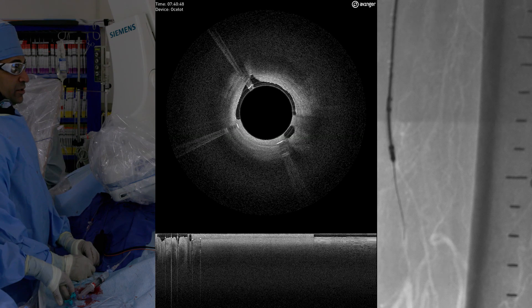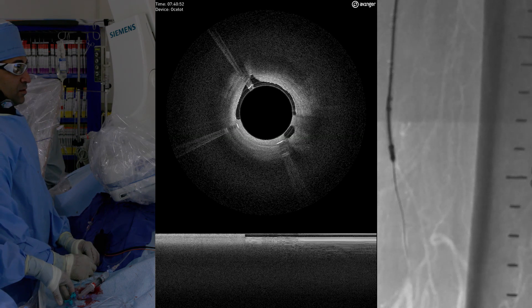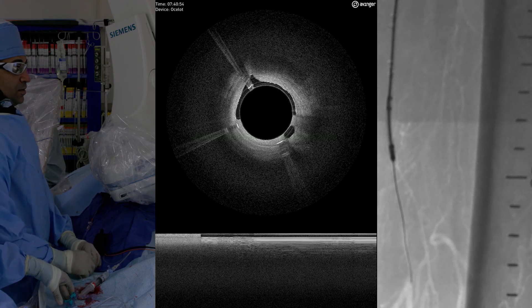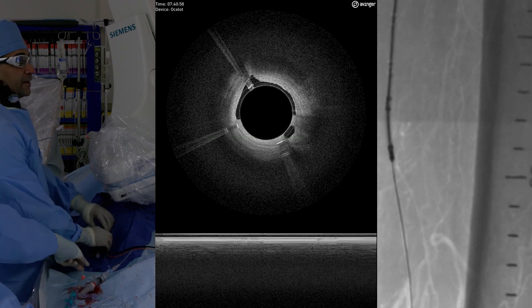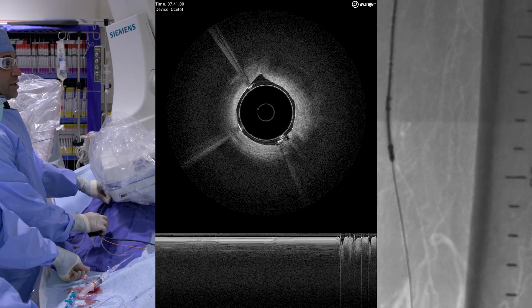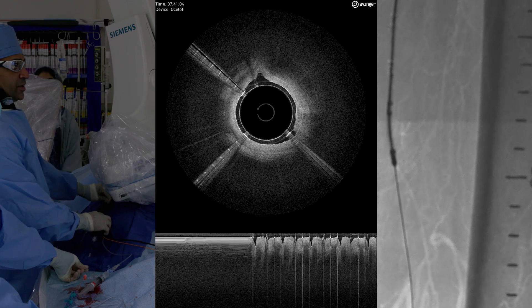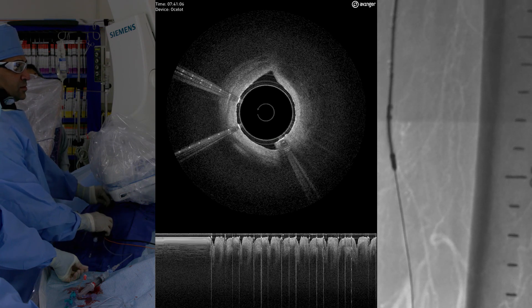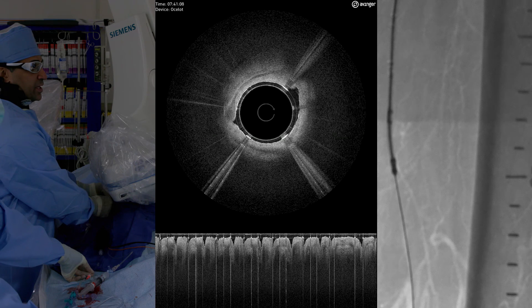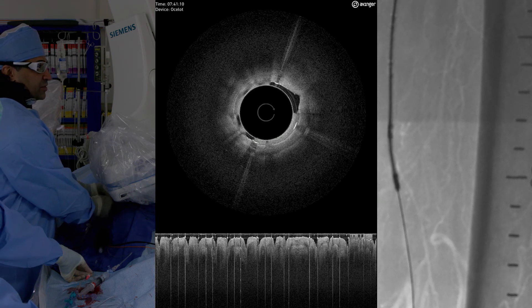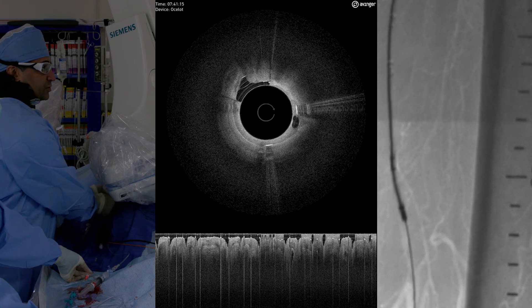Let's bring our Ocelot down to here. And I think we're through, my friends. So we're going to hold on to that and we're going to advance. Any non-hydrophilic wire with a stiff tip, doesn't matter what it is — I like that for getting through the distal cap.